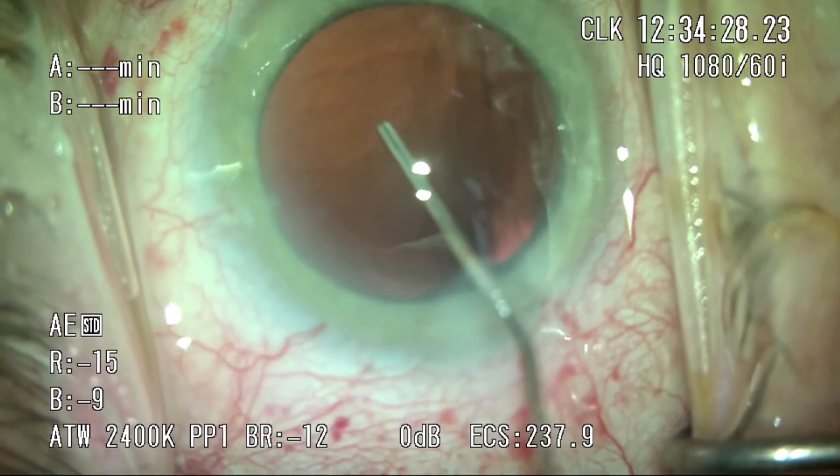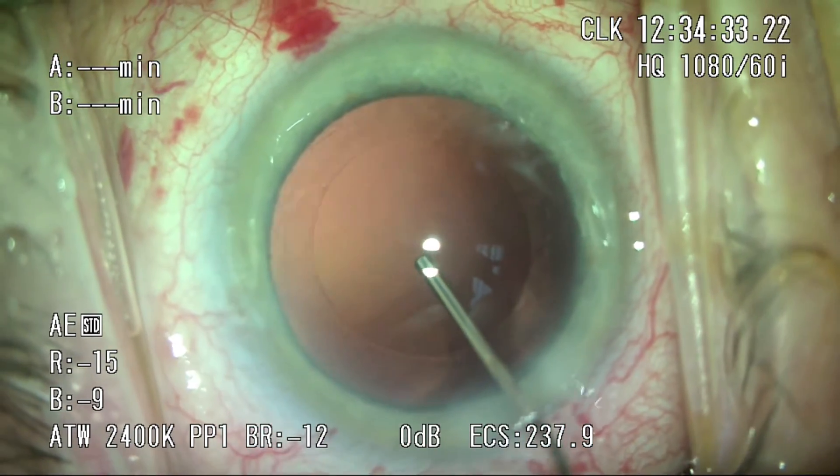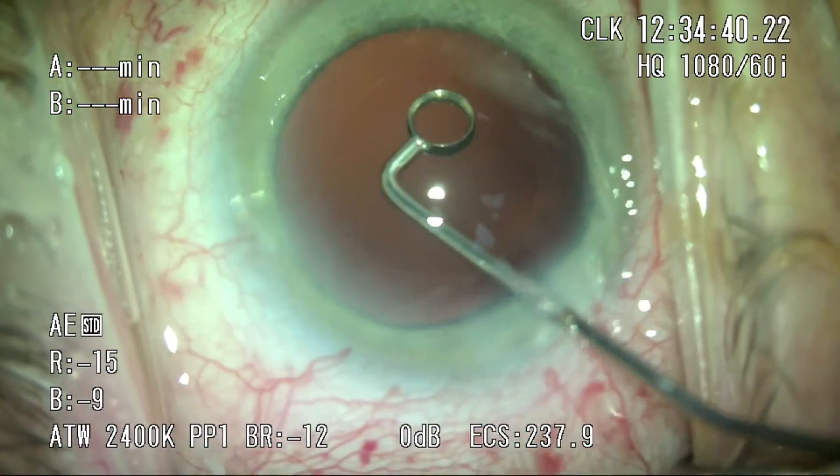This is a good time to point out that this patient has pseudoexfoliation, and you can see a bit of the bull's-ring sign left on the anterior capsule. I think femto is a great indication for these patients because it's certainly a lot less traumatic due to reduced intraoperative manipulation.